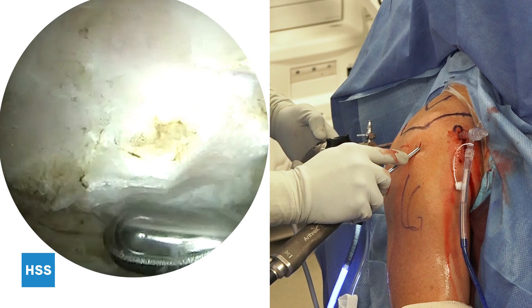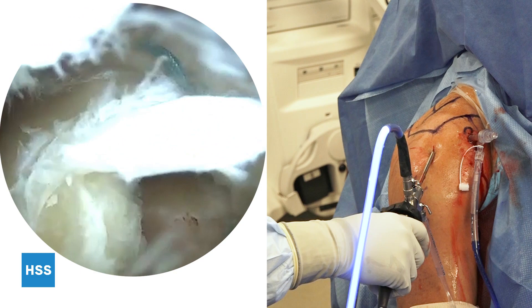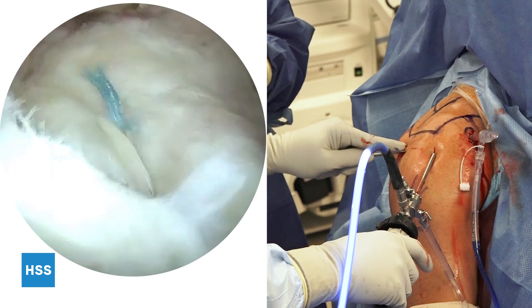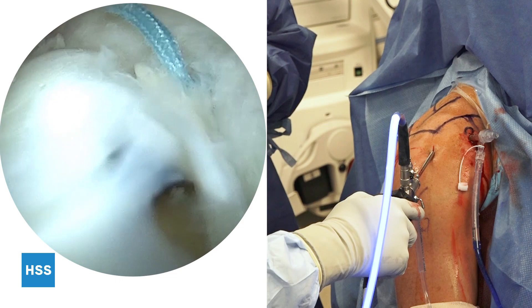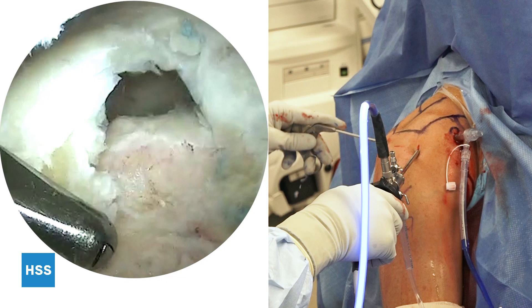After adequate acromioplasty, the arthroscope is inserted into the anterolateral portal to ensure there has been adequate resection of the subacromial spur. Since that portal site was established directly over the tear, I simply turn my eyes south and see the tear. You can see the degenerative tissue and where the previous sutures are from the prior rotator cuff repair. I then establish a posterolateral portal, which will be largely used for viewing. The tissue appears avascular and thin, as is typical with recurrent ruptures of rotator cuff tears that have already been repaired. Using a grasper to assess the tear configuration, it is most consistent with an L-shaped tear.